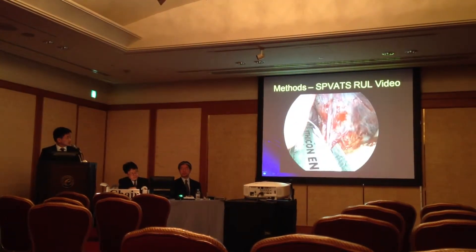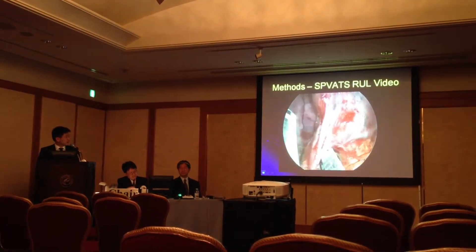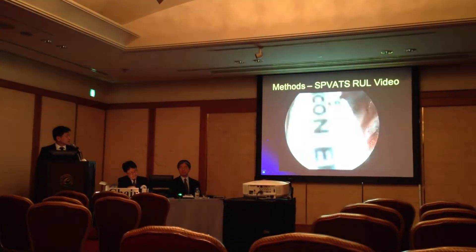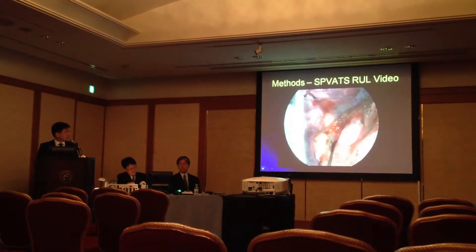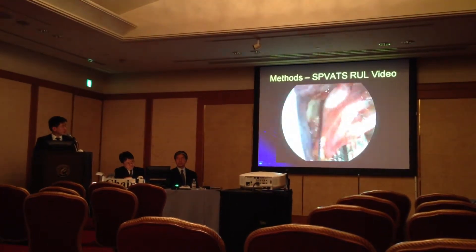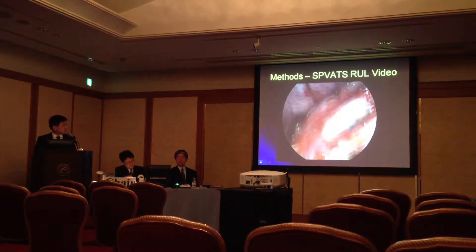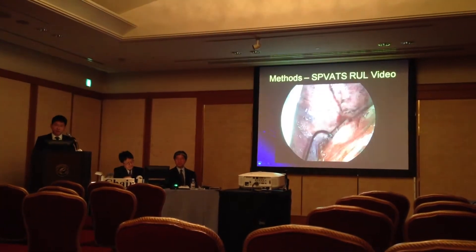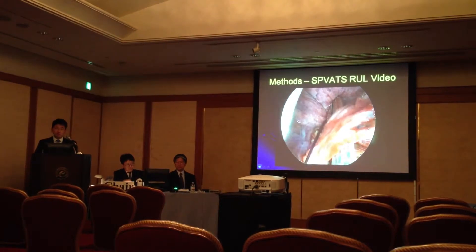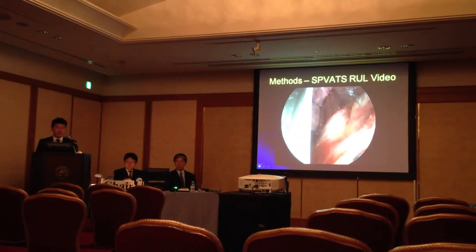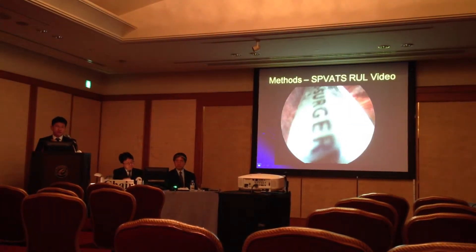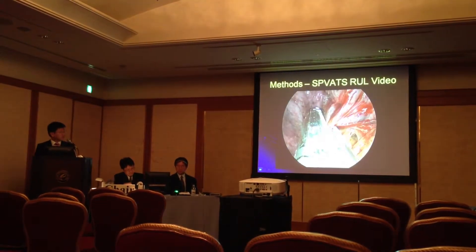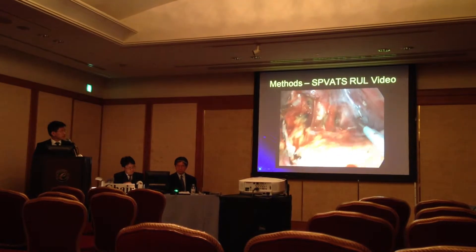We routinely sling our vessels with a heavy suture tie and, using a flexed endo-stapler, we push it through and staple-resect the pulmonary vein. You'll notice the camera moves a bit with single-port because all the instruments are competing in the same space — you're fighting with the cameraman. Every time you move the retractor or the dissecting instrument, the camera will move a little, but you just have to get used to that.